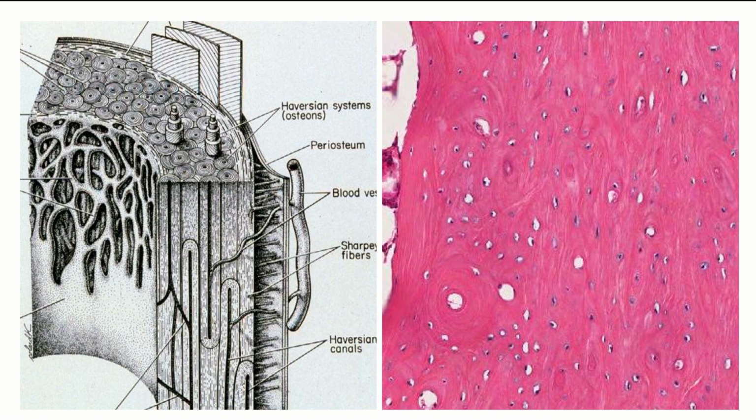Okay, and here is a better way to see, on a large scale, how everything's set up. This is the compact bone on the outside layer of that bone, right? And inside we've got spongy bone. But here you can see we've got all of these Haversian systems, and they're all lined up. In the center are those Haversian canals, right? And remember, we said the canals that go transversely and connect one Haversian canal to another are Volkmann's canals.